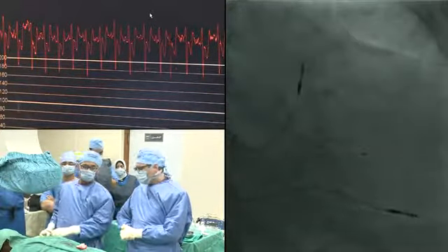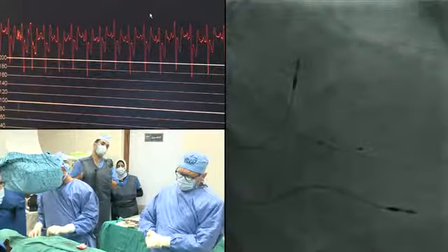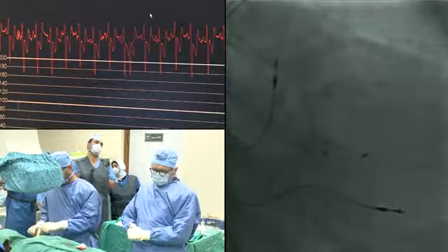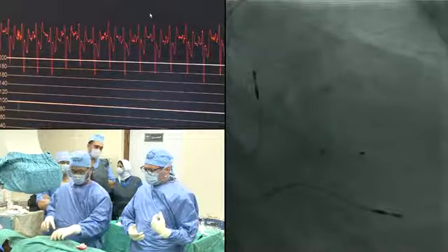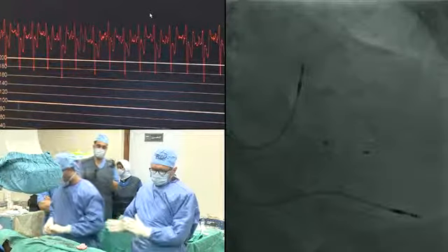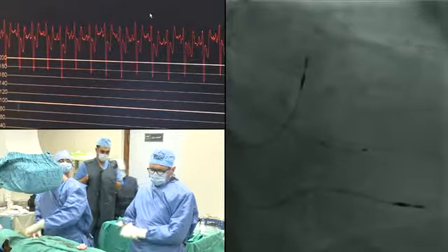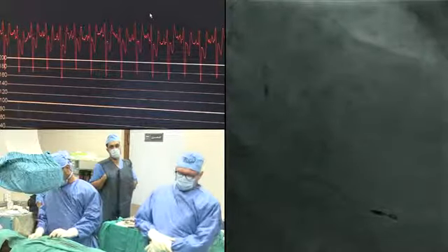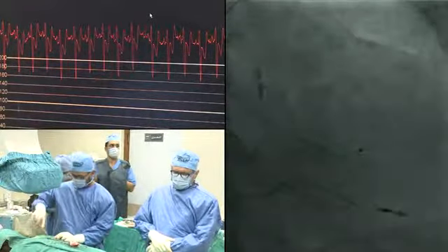Do you think cephalic vein can withstand 3 leads? You know, that was my other point. I think that the advantage of cephalic vein cut down in devices is to reduce the likelihood of subclavian vein crush. But if you take a very small, as is often the case, cephalic vein and pass 3 leads down it, I'm not sure you necessarily have any advantage over an axillary vein or subclavian vein approach.